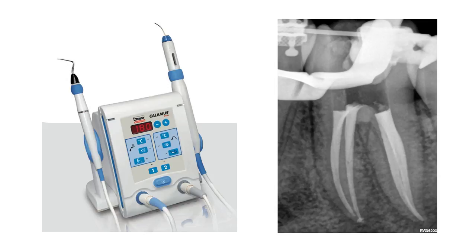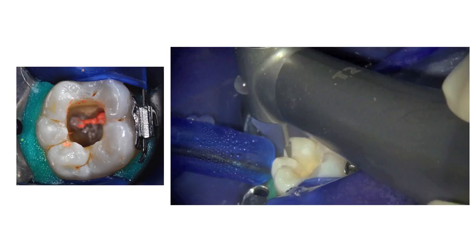This periapical radiograph illustrates the immediate postoperative result of the obturation of the root canals. Here you can see the occlusal view of the tooth showing the access cavity after obturation of the root canal system.